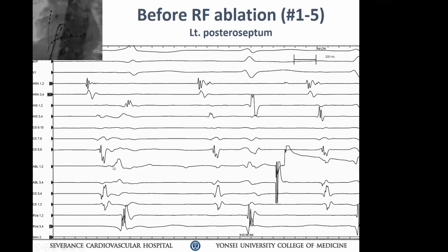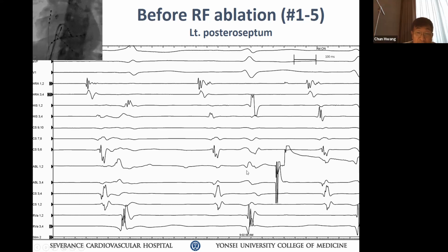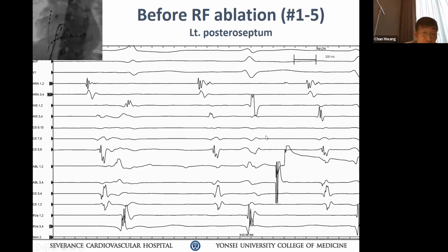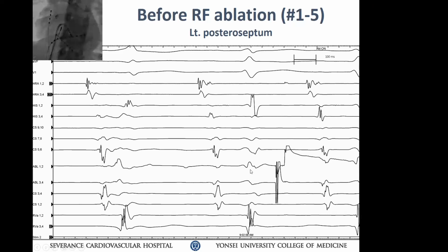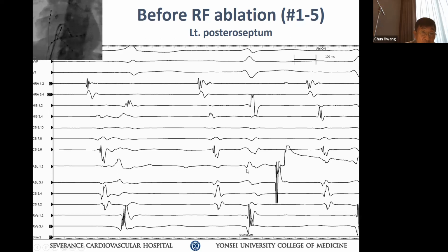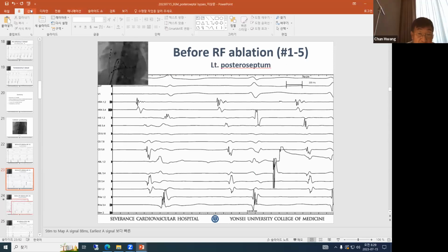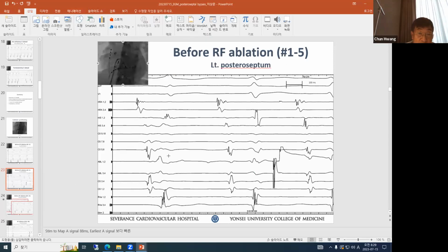사이너스 상태에서 얼리스트 V 범프했어? 여기서? 이제 범프, 좀 범프가 의심되는 자리였던 것 같아가지고. 저때가 EGM 보면은 ablation signal이 local signal 아닌데 봤어? It's not sharp signal. 네 맞습니다. You see, far field A, and then there's some noise, and then you got V. 그렇지만 draw the line there from that far field noise, first complex, first ablation distal. 그 보면은 델타보다 빠르긴 빠른데 아주 빠르진 않은 것 같고.